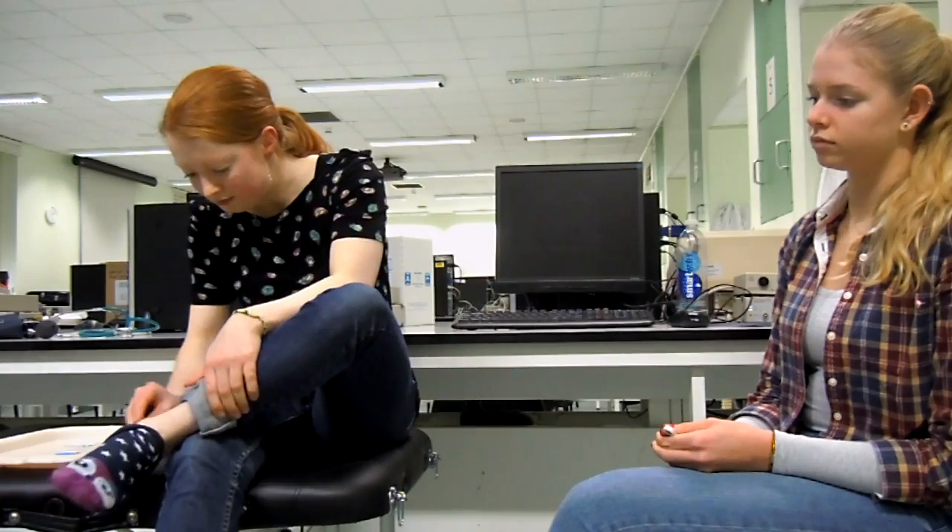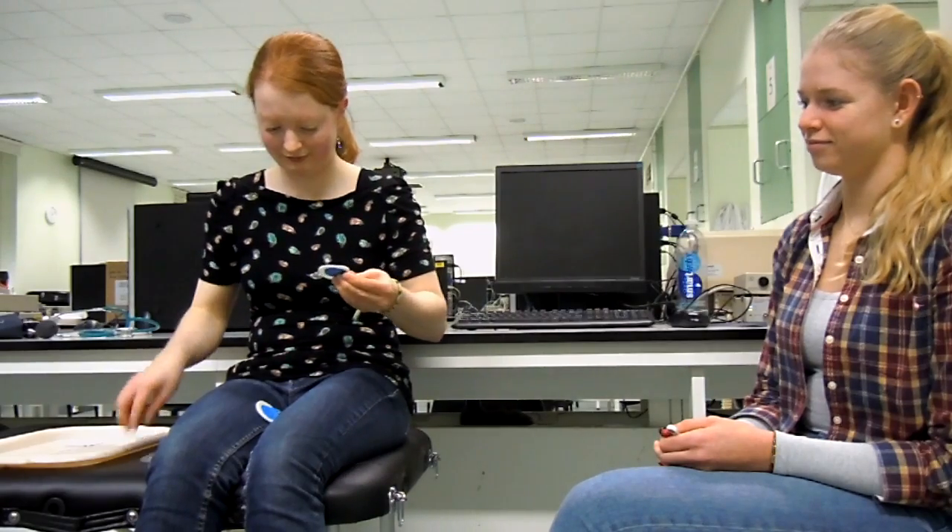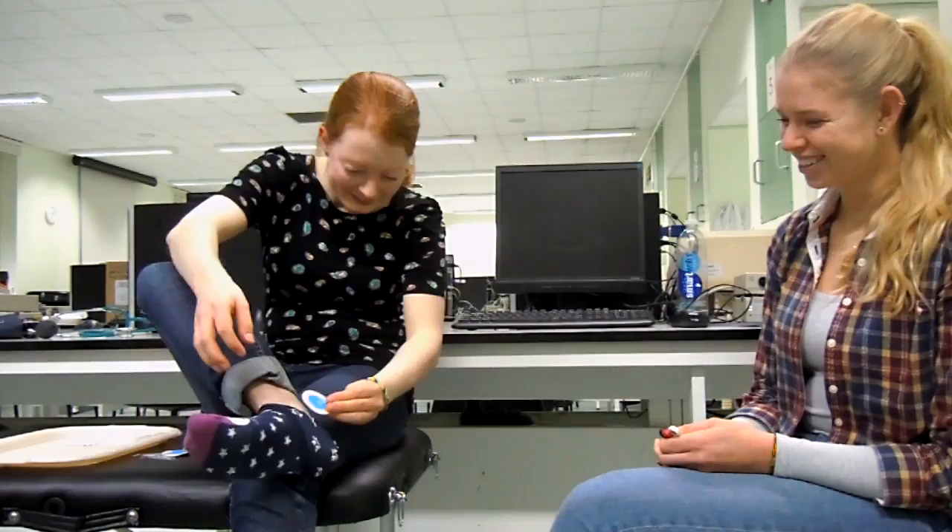The second part of your practical experiment is going to be measuring your respiratory sinus arrhythmia with the use of an ECG, and we're going to show you the setup. You're going to start with an alcohol wipe, cleaning the areas of the skin to put the electrode pads on — the right wrist and right and left ankles. Then using your ECG pads, you're going to stick those to your right wrist and right and left ankles.